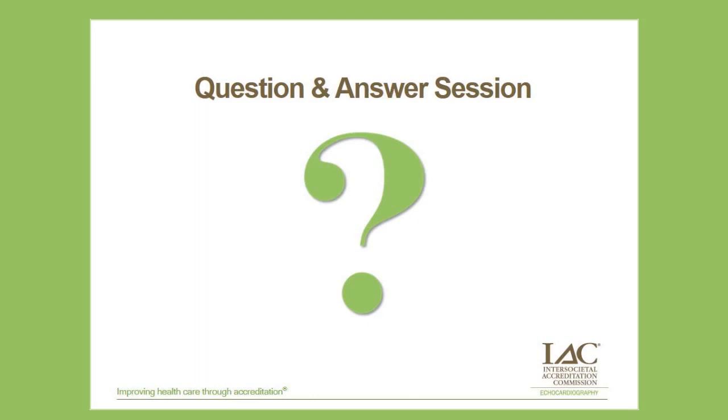So the expert consensus, and the same applies to ejection fraction, mandates that you repeat the exam within 3 weeks, because you want to be 100% sure that if you are going to be blowing the whistle, you have two different sets of images in two different moments of time where you are seeing exactly the same thing, for the reasons that I explained before.